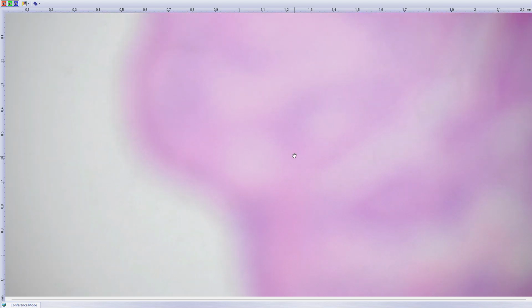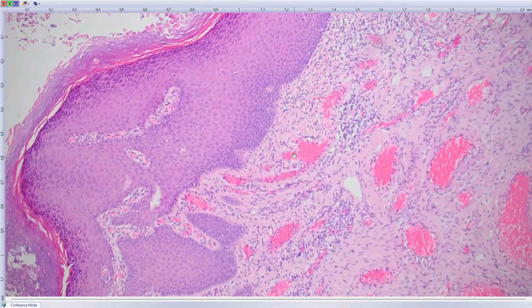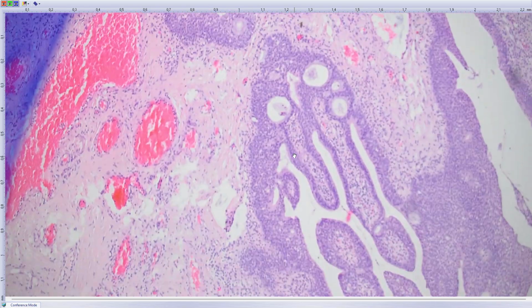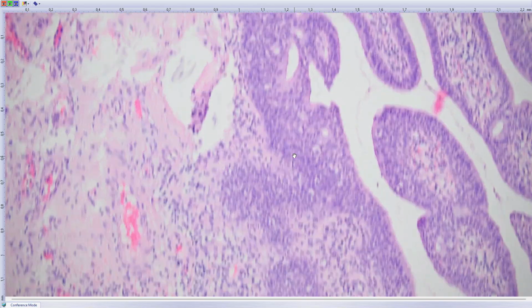And when we speak about these lesions, I should show you one lesion that is in differential diagnosis to it. It's a skin lesion, which mostly has basaloid appearance like that. And all of a sudden you see here again adenomatous differentiation that is rather benign.